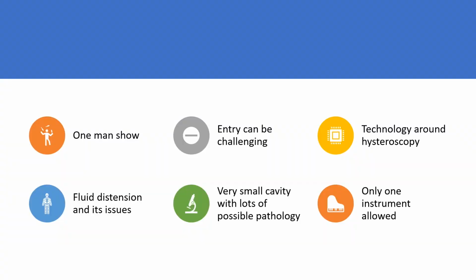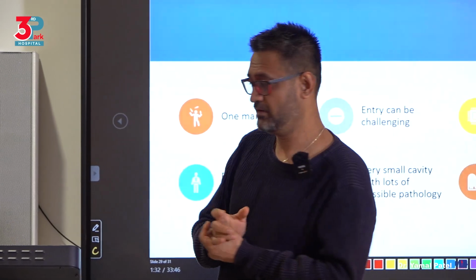You need to understand fluid distending media and its issues. The uterine cavity is actually a very small cavity with lots of pathology. So you have a very limited space to play around with in hysteroscopy. Whereas the same in laparoscopy is different. You have a whole abdominal cavity.